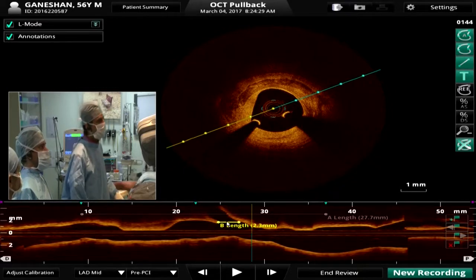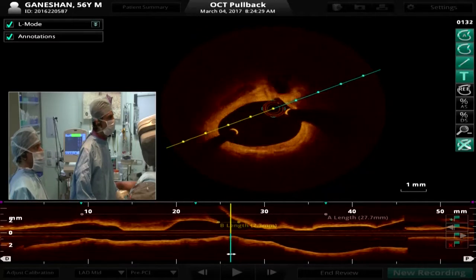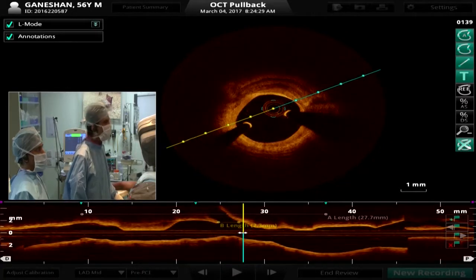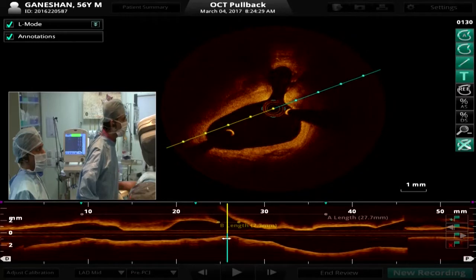Yeah, the side branch appears to be 2.2 or 2.3 millimeters, and the ostium is not much diseased. Sorry, the other point is the proximal to the diagonal. Yeah, no, my question was not about two stents for the bifurcation.